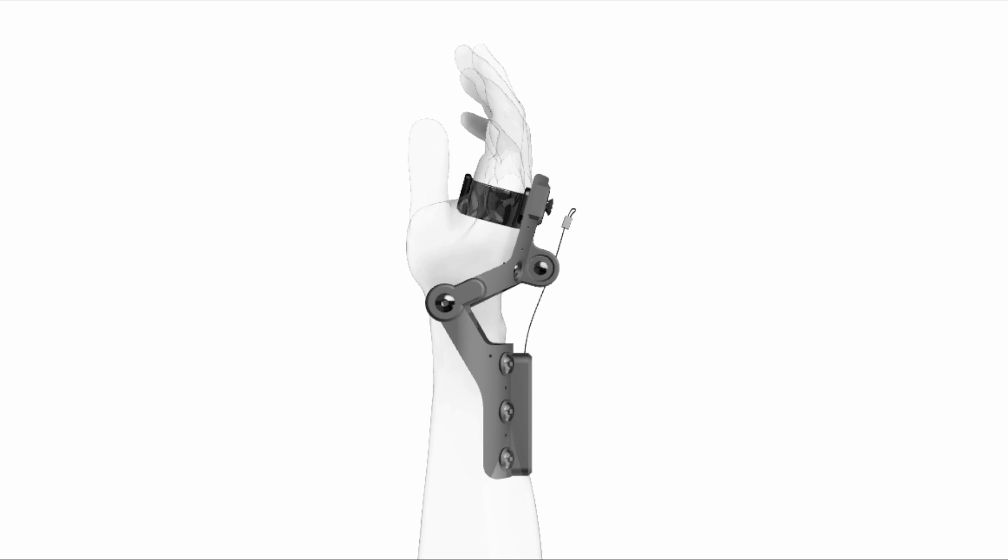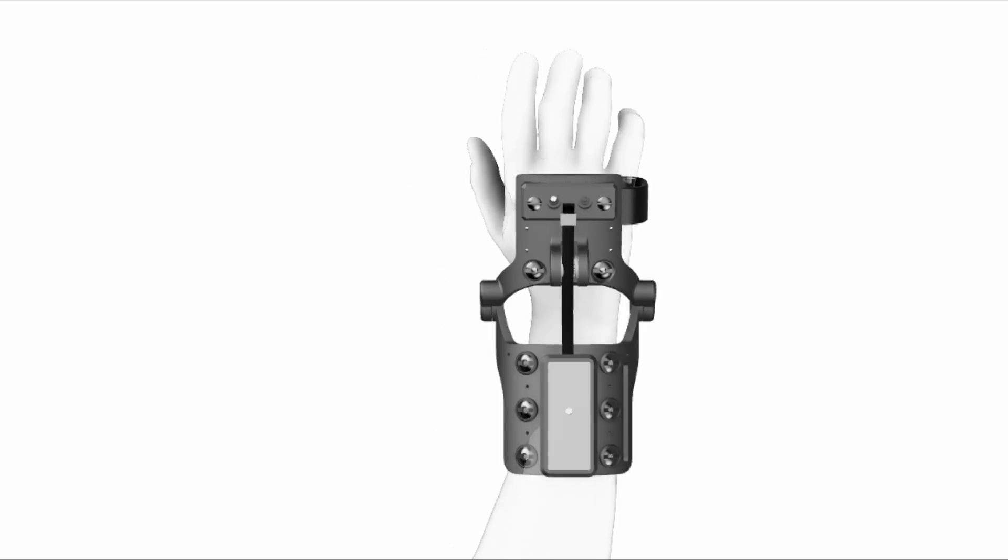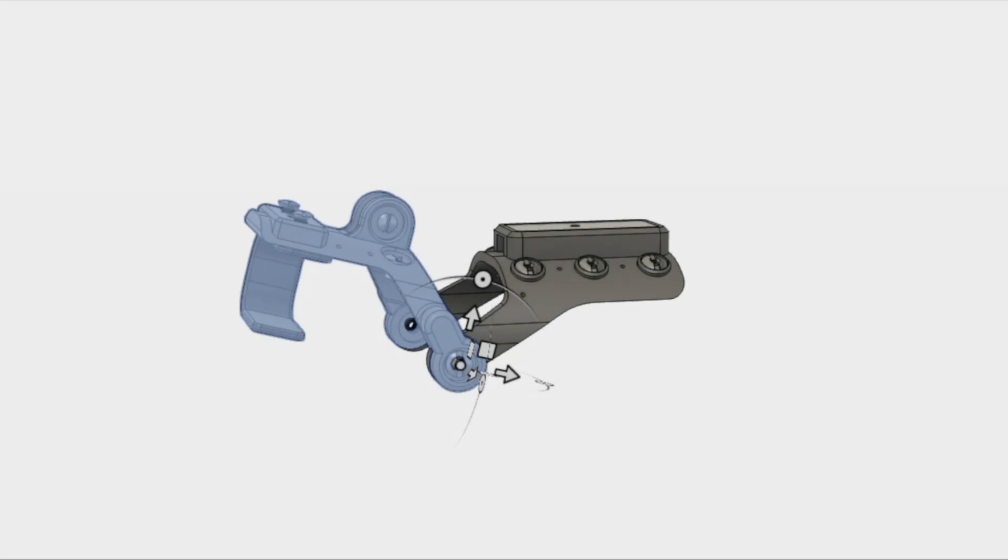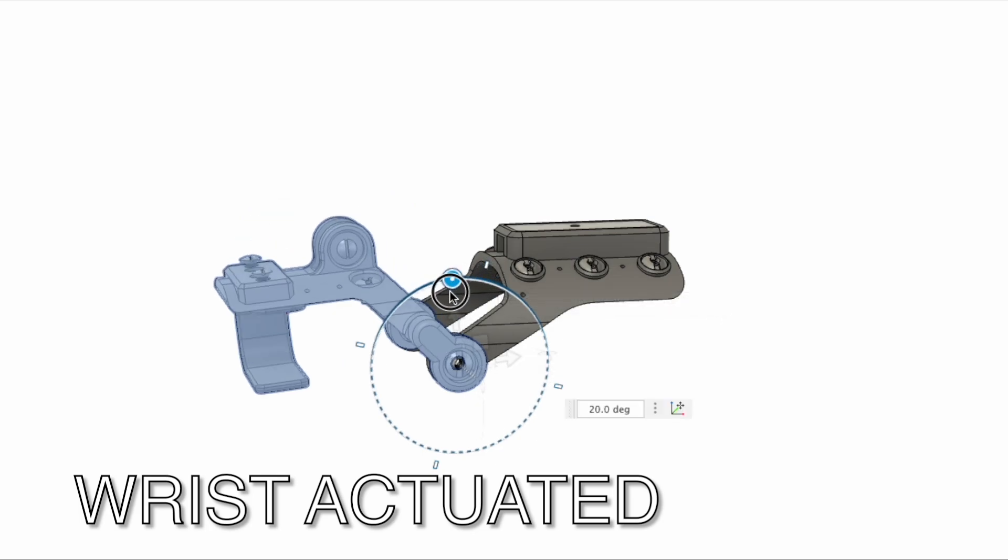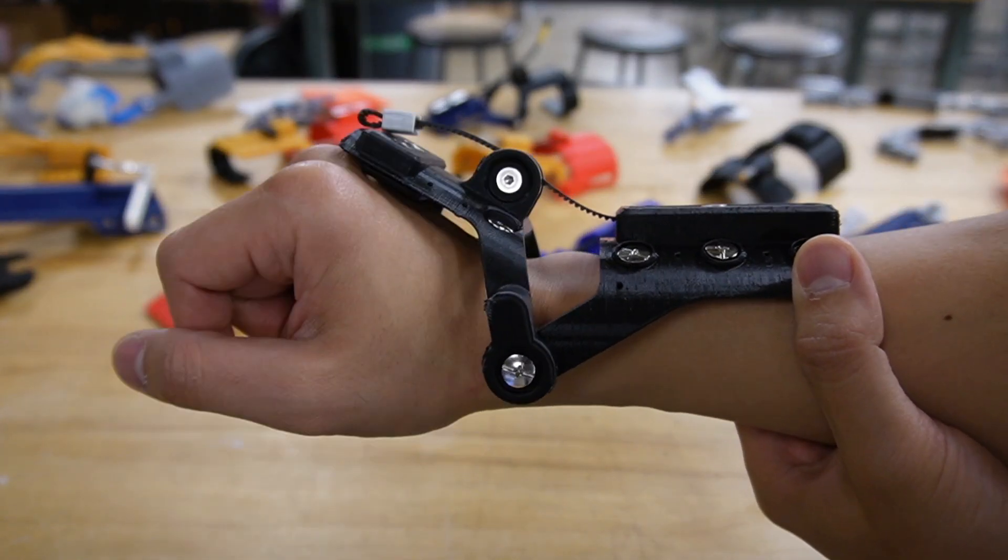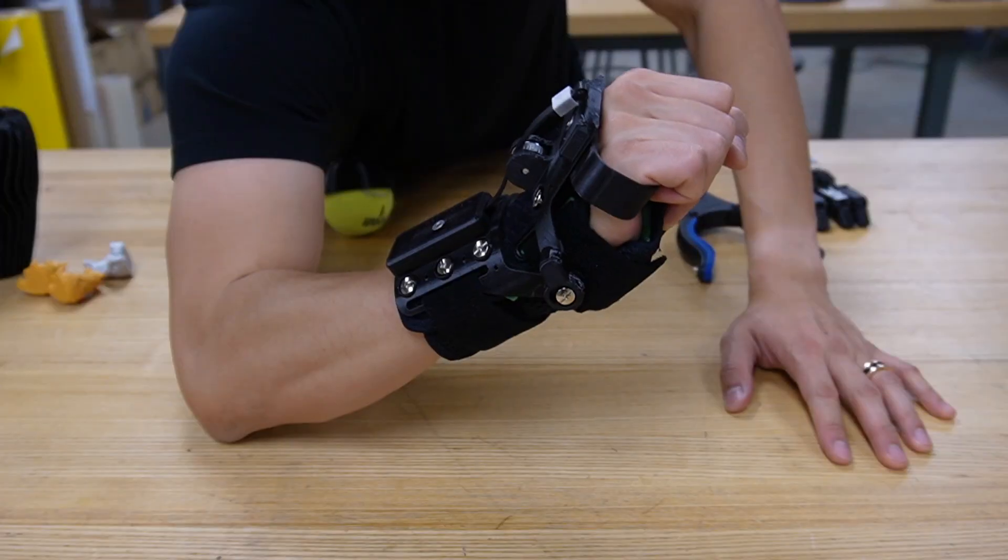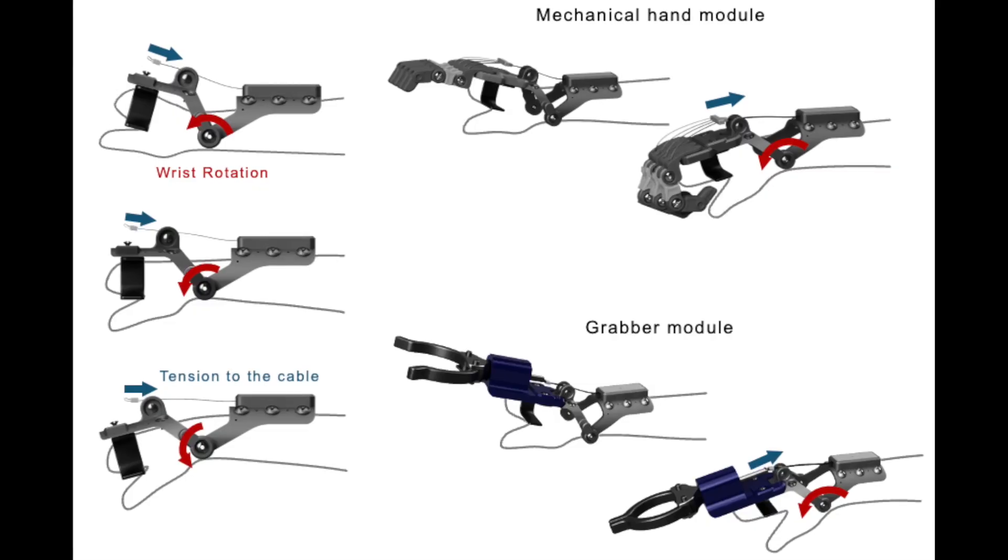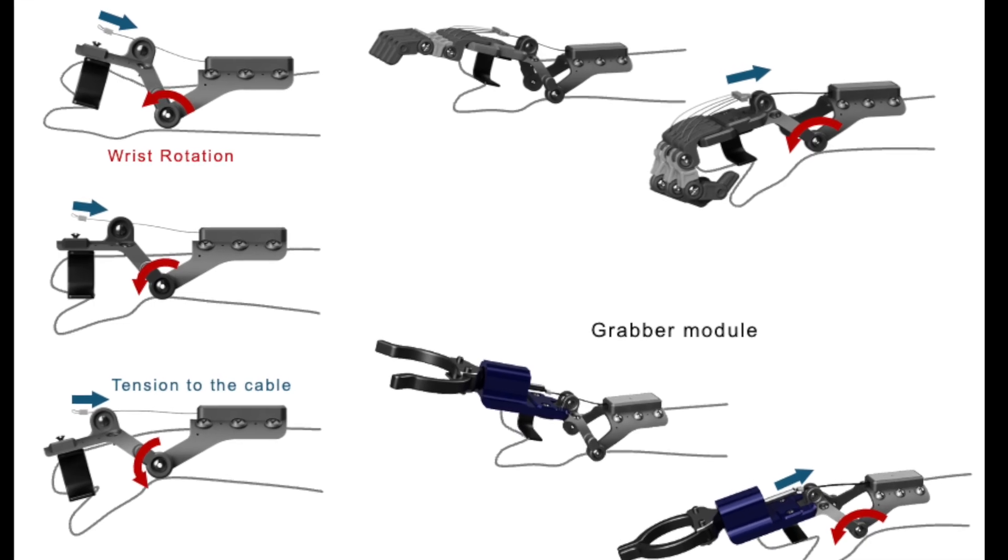Second is wrist actuated mechanism. A slight, about 20 degrees rotation of the wrist activates a pulley mechanism creating translational motion that operates various end effectors through the belt system.